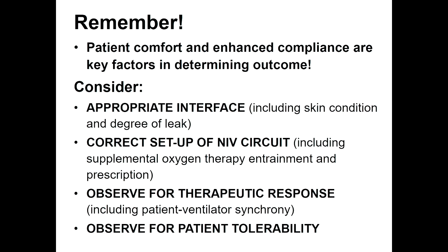Observe your patient for a therapeutic response. Look to see that you're achieving the targets of therapy. You're looking to see that the patient's respiratory symptoms are improving appropriately with the use of the non-invasive ventilation. And of course, observe for the patient's tolerability. Make sure that they are comfortable and that they are tolerant in using the machine to achieve a therapeutic benefit.